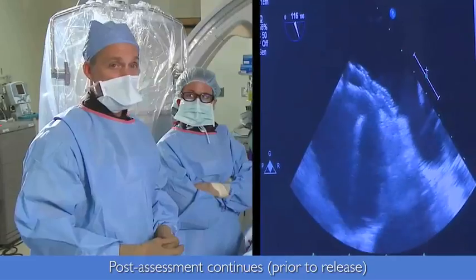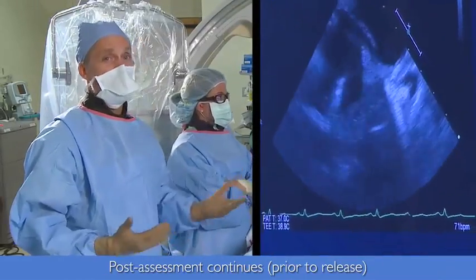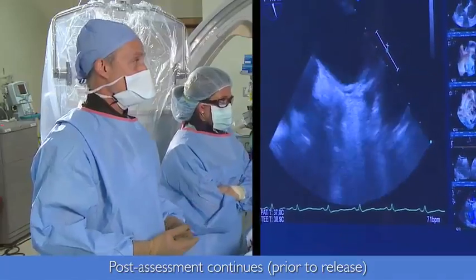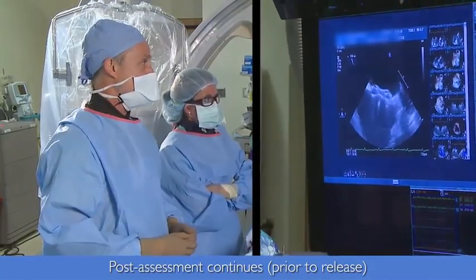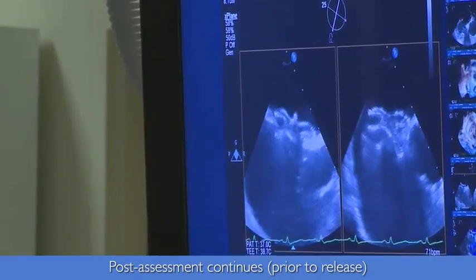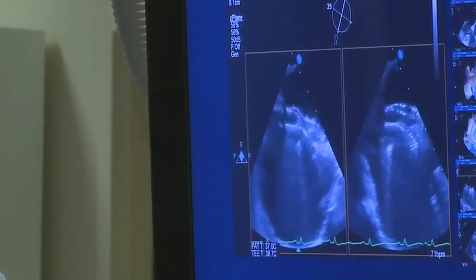But in some patients, it may be a longer duration process that we have really no way of monitoring because we're really talking about a single layer of tissue growing over the device. And really we're just spending some extra time here to be sure of our result before we release.